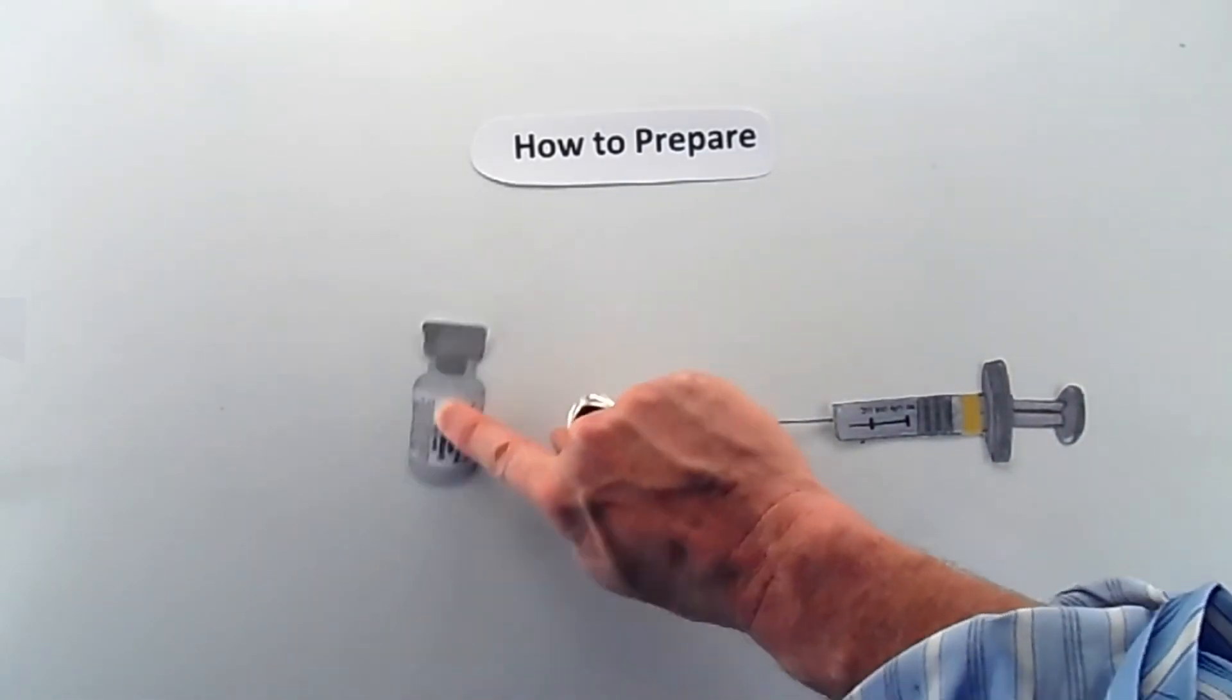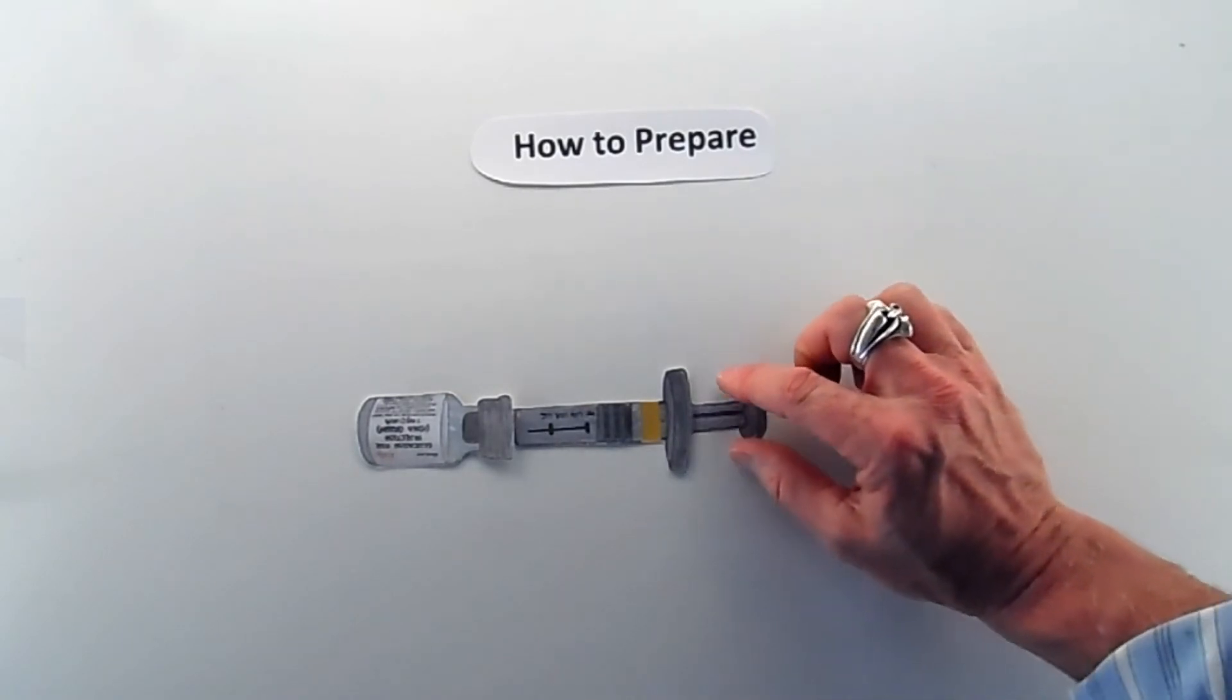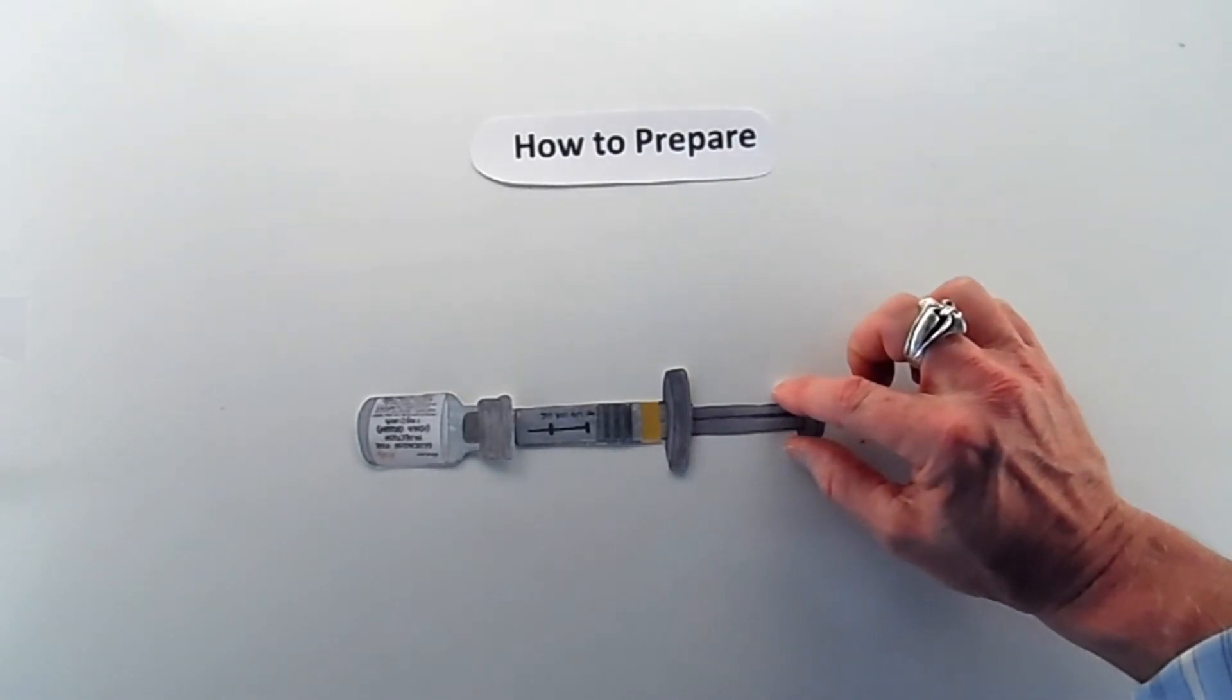Remove the syringe from the vial and gently shake the vial until the liquid becomes clear. Using the same syringe, withdraw all of the liquid from the vial.